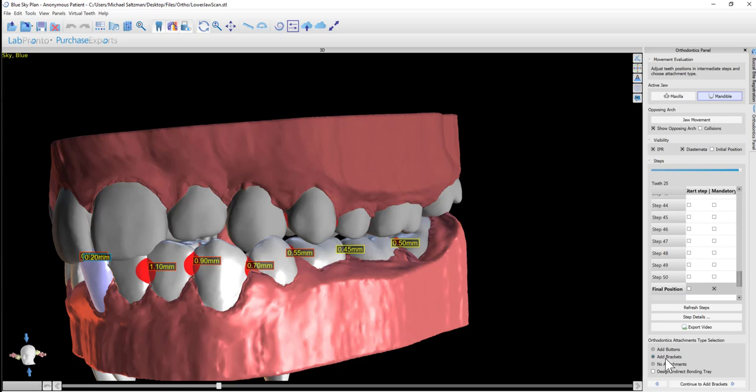Once add brackets is selected, there's an option to design an indirect bonding tray. We're going to select that as well. It's not required — the brackets could be added to the models and exported from the software, and the indirect bonding tray can be manufactured manually.